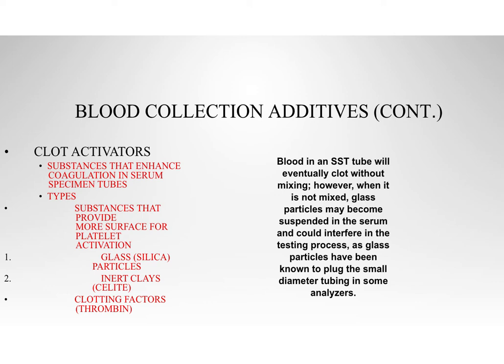So we do need to know that clot activators are substances that provide more surface area for the platelet to activate, right? So the platelets are like, oh, there's an injury. We came out of the vessel. Things are not right. And they're looking to stick to something to clot, okay? Now, this actually happens naturally, but that can give you a visual of what those clot activators do, what their job is, okay?